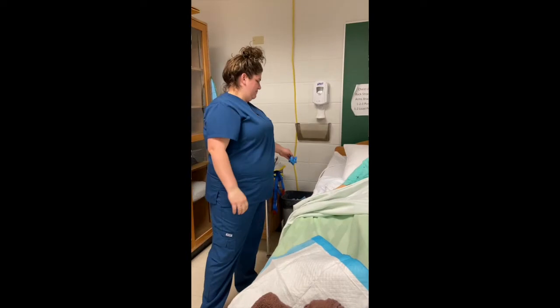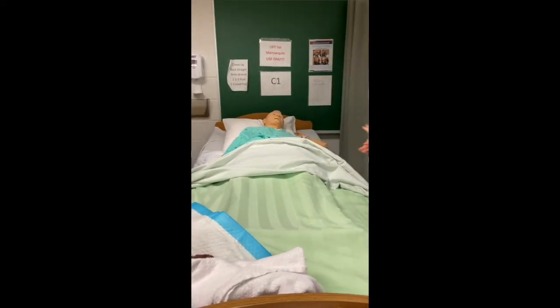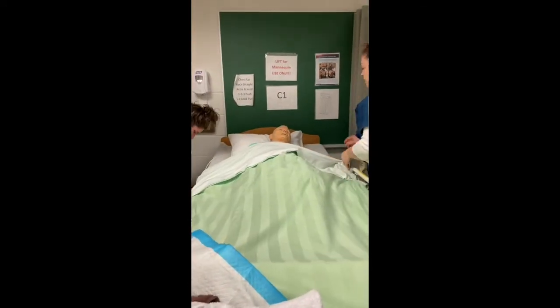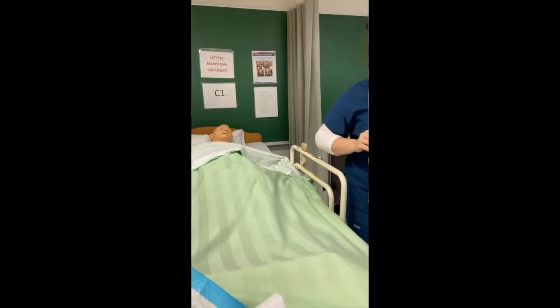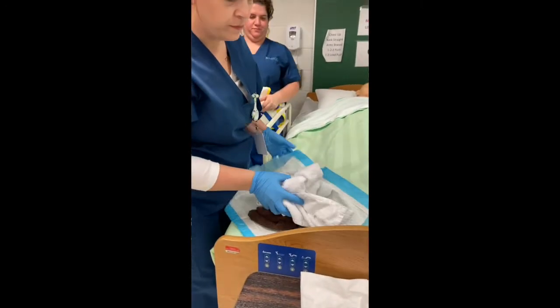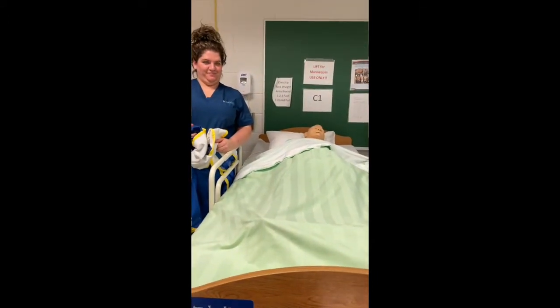We doff our gloves and we perform hand hygiene. We raise the bed rails and I apply clean gloves to remove the soiled materials from the room. After I perform hand hygiene again, we are ready to prepare our patient for the mechanical lift.